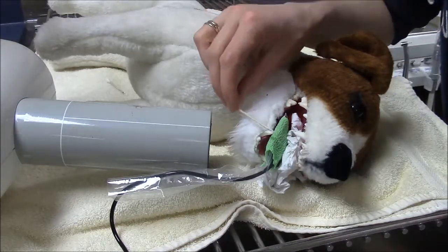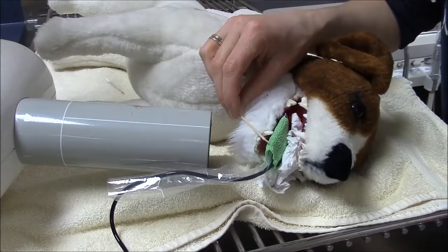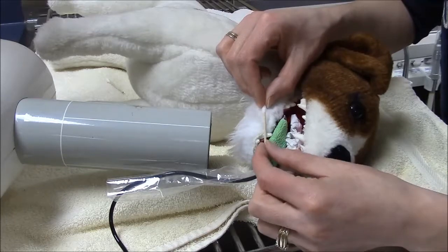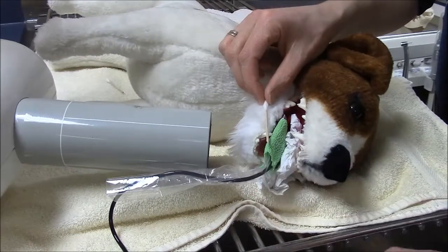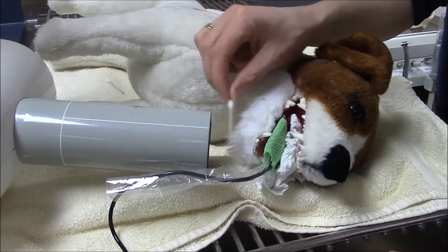Standing at the patient's side, you're going to remember that the incisors curve into the skull, so here's my long axis of the tooth root. I see the edge of the film that I need to use, so halfway in between is here. Look at the position of your cone — ideally you want your stick to be flush with the end of your cone, and then you know you're aimed at your bisecting angle.